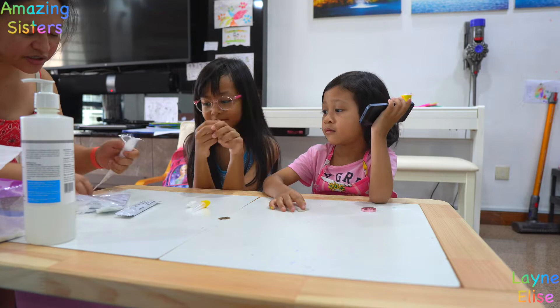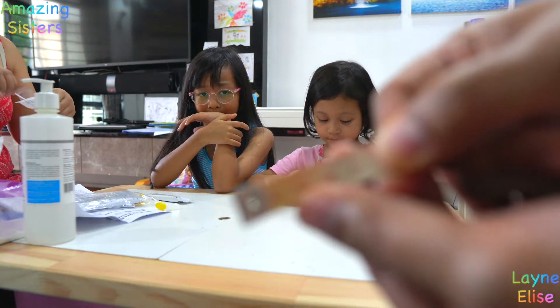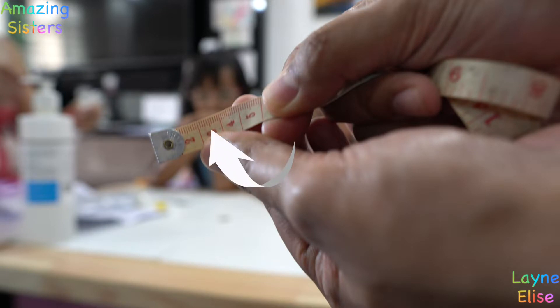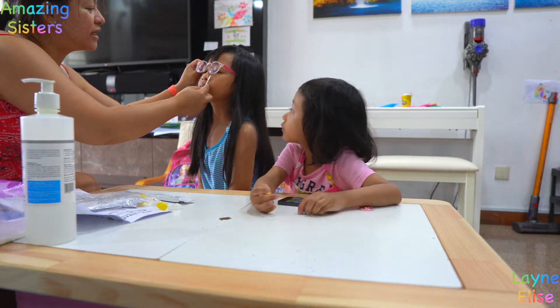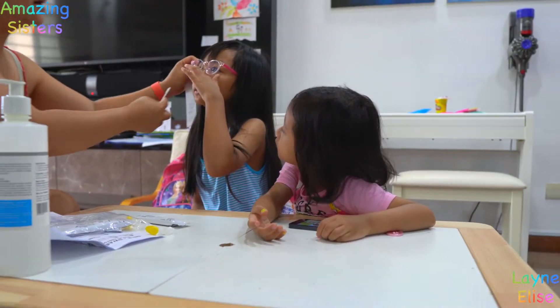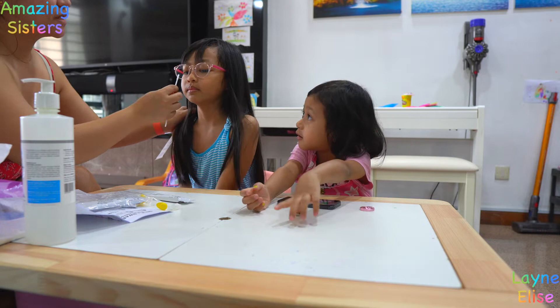You see, the instruction is — it's not painful at all. So 2.5 cm is... it's okay, Ate. Is it a punch? It's not until here. It's still here? Here only? It's okay. Go, start now.